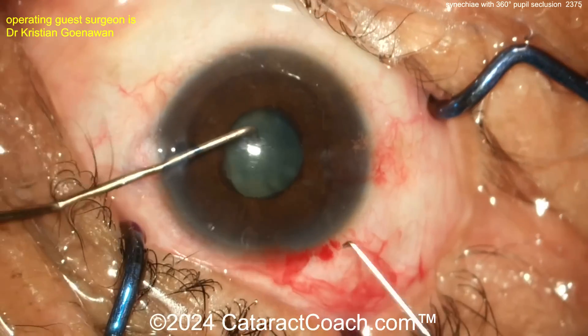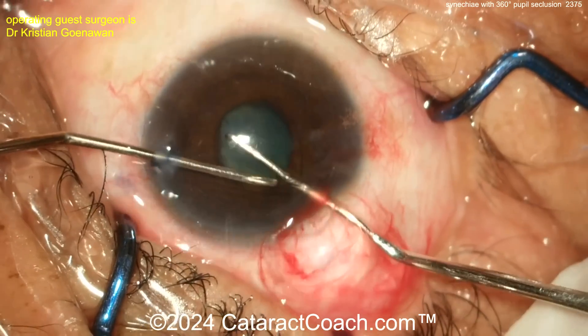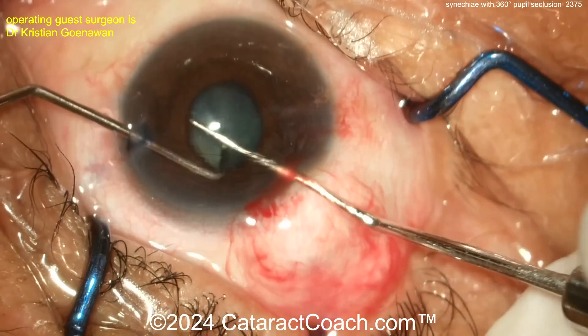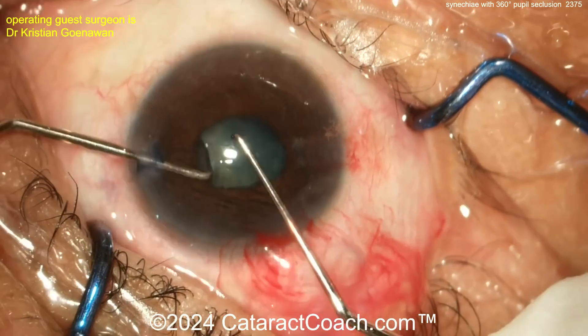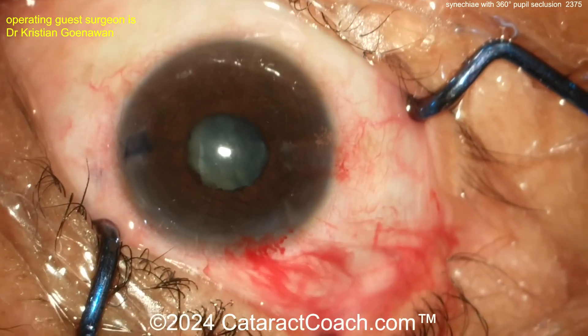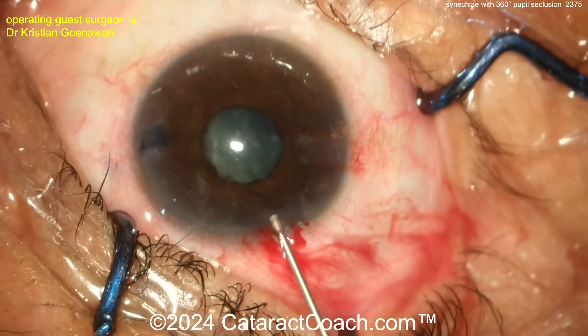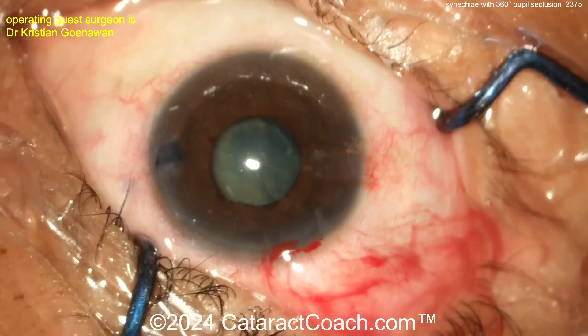Coming in with a chopper in one hand and a Sinskey hook in the other — be very careful not to damage the anterior lens capsule, that's the key. Going in to get a bit of a stretch. Sometimes it's easier to put the instruments through the two paracenteses to avoid flattening the AC with loss of viscoelastic. When you do the pupil stretch you'll cause little sphincter tears at the pupil margin, and that's okay — it's expected.